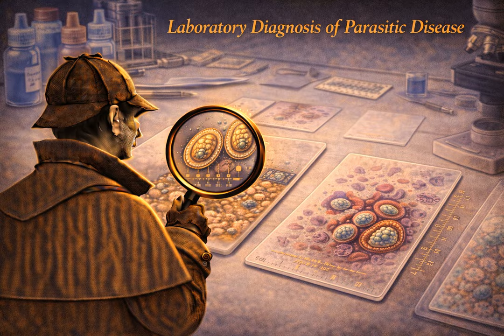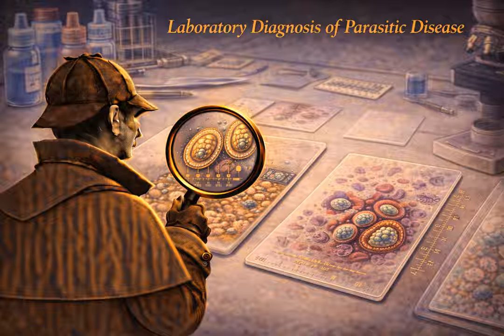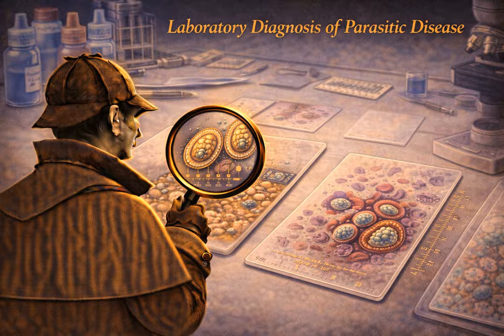Murray says you have to wait at least 5 to 10 days for that barium to naturally clear the GI tract before you can even attempt an O&P. It's like trying to find a clear contact lens dropped into a glass of whole milk. That's exactly what it looks like under the scope. The other big deal breaker is recent antibiotics, specifically things like tetracyclines or anti-malarial drugs. You generally need to wait a full 2 weeks after those medications are stopped.